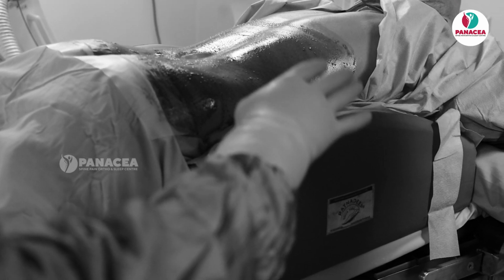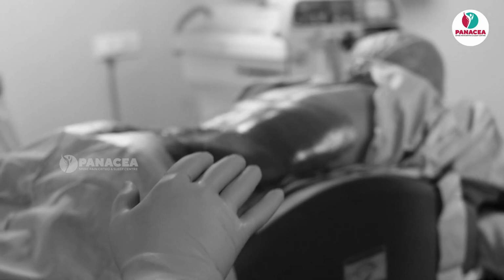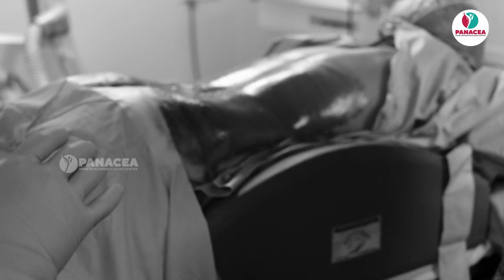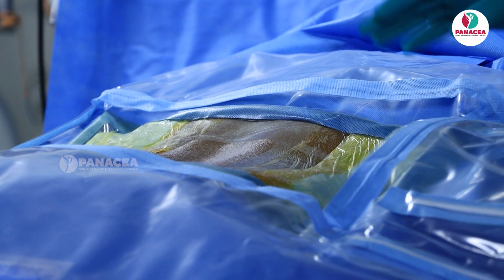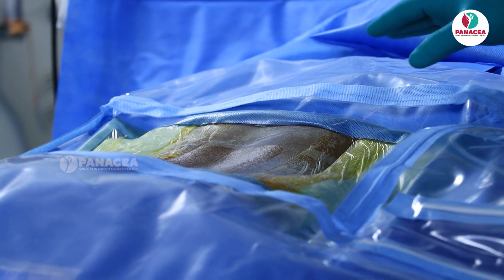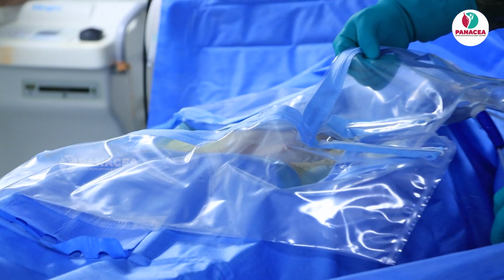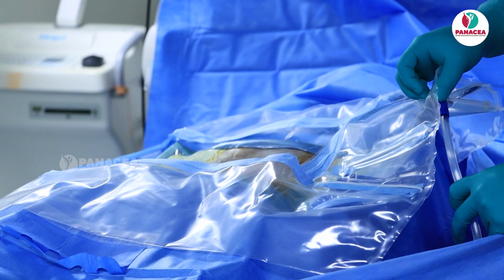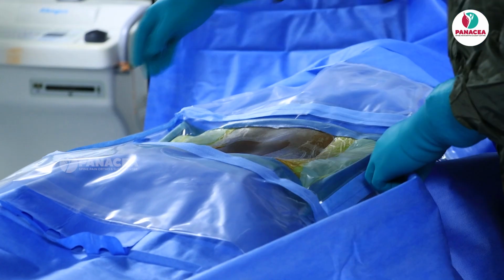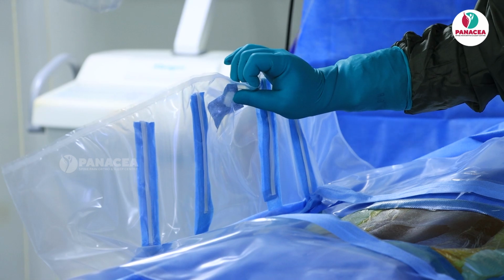You can see here, the patient is conscious in prone position. We have wedged the table, and this is all to increase the interlaminar as well as foraminal dimensions. We are going to kyphose the lumbar spine. This is a position adopted. This is an endoscopic spine drape. It has a water collection bag for the egress saline which comes out of the endoscope. We have connected a suction drain here. On the other side there is also one port for egress fluid to be drained.